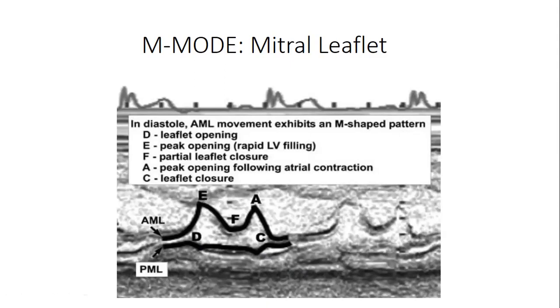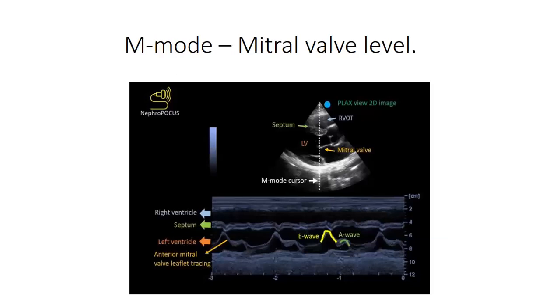Okay, thank you so much for the good explanation. My other question was, when we're getting the EPSS, are we only restricted to positioning the scan line on just the tips of the mitral valve leaflets and the septum? Yes, you are restricted to do that. My question is, where else do you think we can put it based on the explanation?